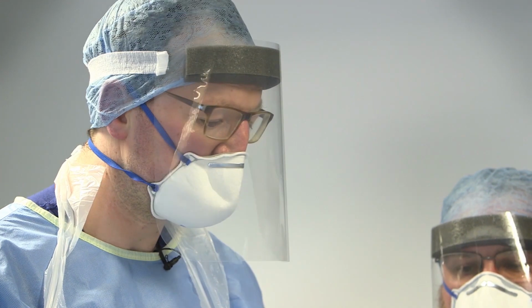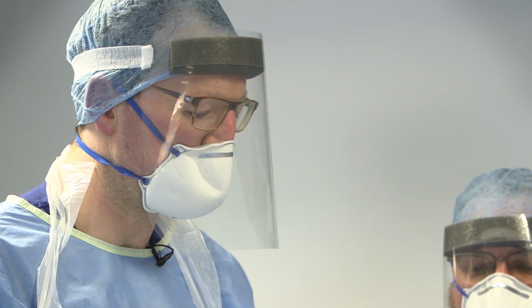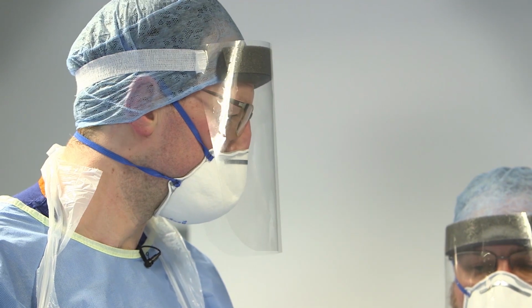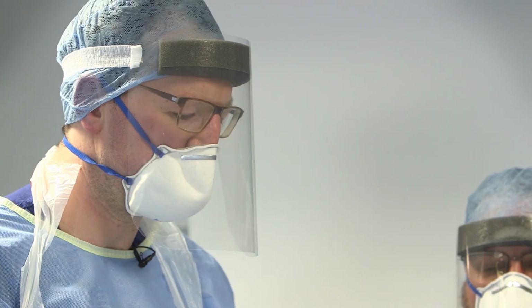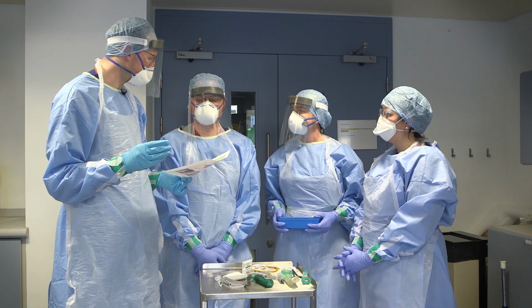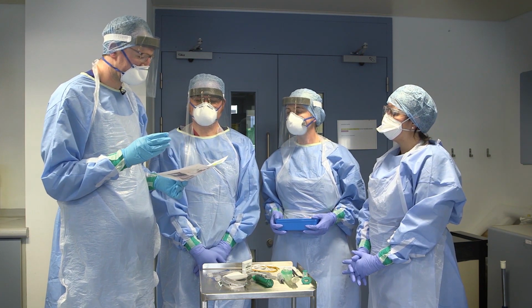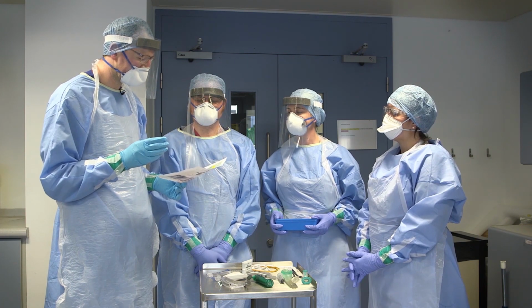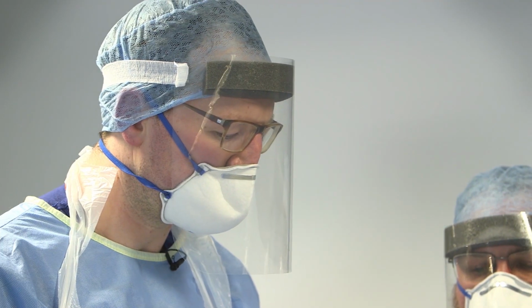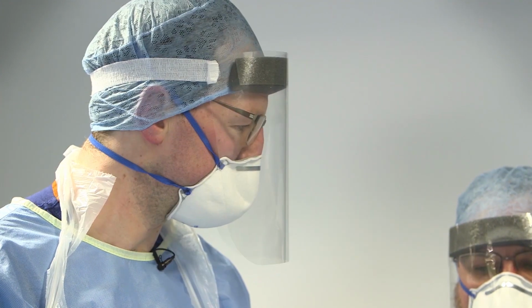I'll have a maximum of 3 attempts, and if failing, I'll declare a failed intubation, at which point, Trev, if you could communicate to Laura outside of the room to access the front of neck access pack and to bring that into the room. So plan B, to maintain oxygenation, will be an i-gel, and failing that, we'll move on to bag mask ventilation, which will be a two-handed, two-person technique.